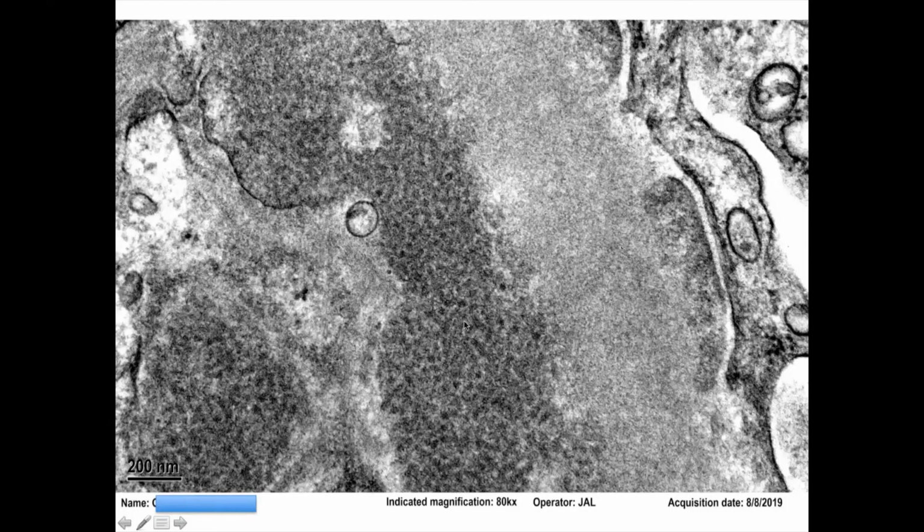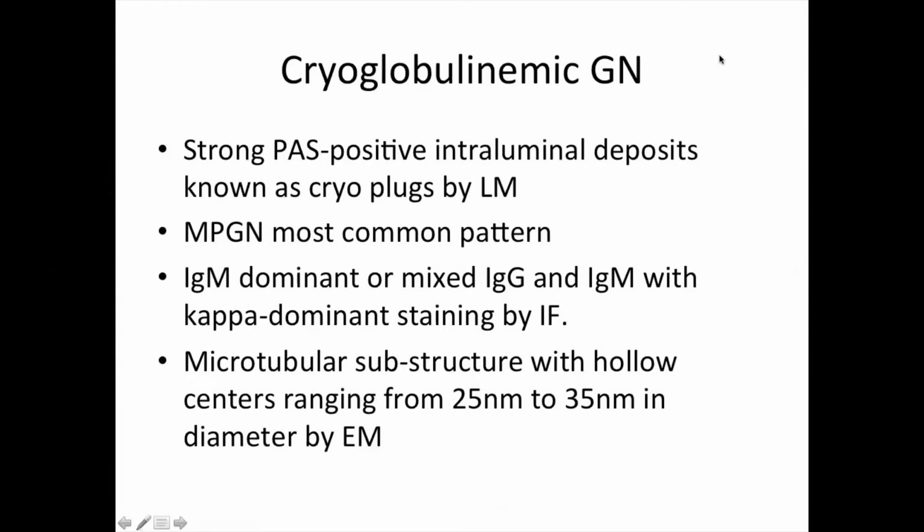And then there is, okay, so basically they are like beads, they are cylindrical, and they have spikes. Okay, actually بعضهم ممكن يكون عندهم spikes. So الشطار اللي قالوا إن this is cryo, it's exactly what it is. So this is a cryoglobulinemic glomerulonephritis.